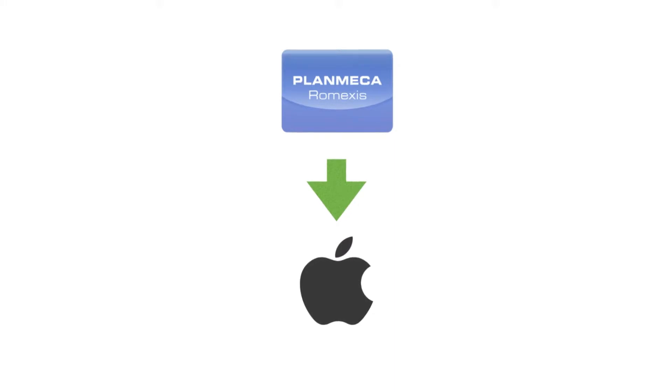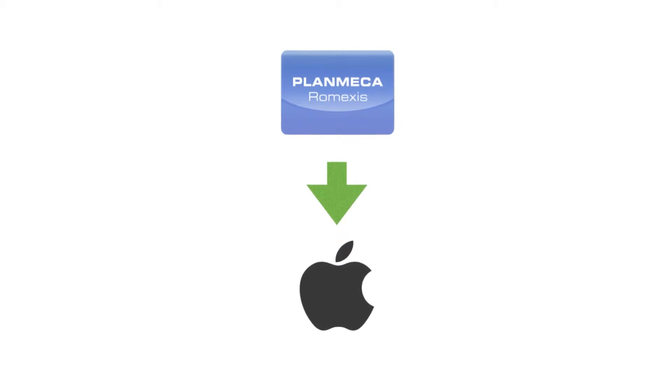The way Romexis works is we have what is called a simultaneous user license. That means multiple clients can be open but only so many at a time. We can technically install Romexis client on as many computers as we want, but only a certain number of computers can be open at once. What dictates that is the license, and the server is going to dish it out to our clients respectively.